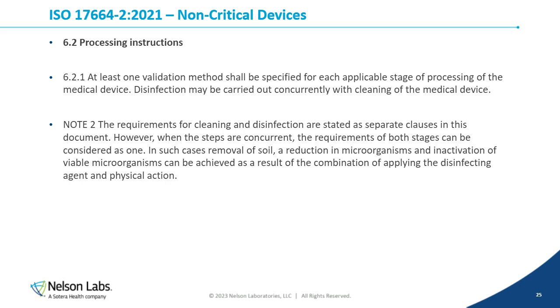And then it goes on to say disinfection may be carried out concurrently with cleaning of the medical device. And then note 2 further says the requirements for cleaning and disinfection are stated as separate clauses in this document. However, when the steps are concurrent, the requirements for both stages can be considered as one.